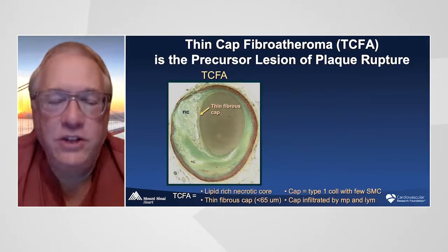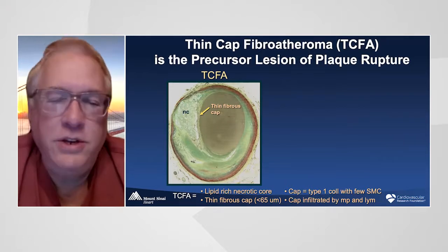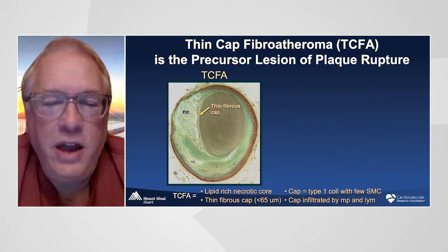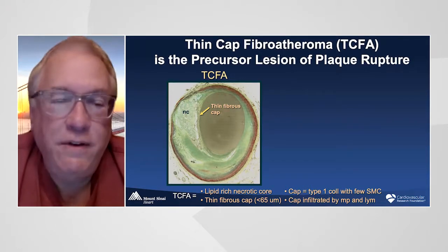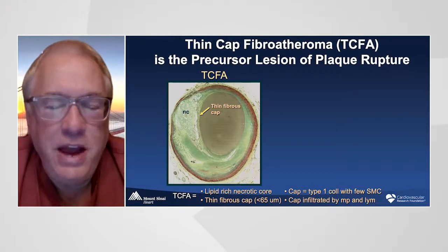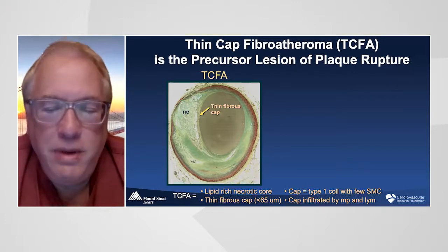And so again, from a clinical point of view, this is what we could call a vulnerable plaque. Now, we've learned from the work of Renu Virmani in particular, who we're really thrilled to have on this webcast, and other pathologists, that for most patients, the cause of sudden cardiac death and myocardial infarction is the thrombosis of an underlying thin-capped fibroatheroma. And this is a TCFA, which has a large, well-organized necrotic core, which consists of cholesterol, cholesterol esters, dead lymphocytes and macrophages and other debris.